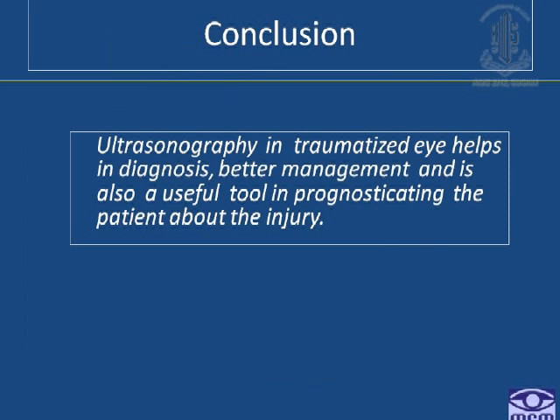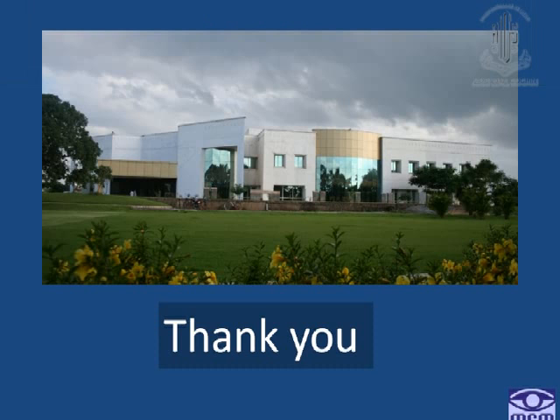So what is the conclusion? Ultrasonography in a traumatized eye helps in diagnosis, better management, and is also a useful tool in prognosticating the patient about the injury. Thank you very much.